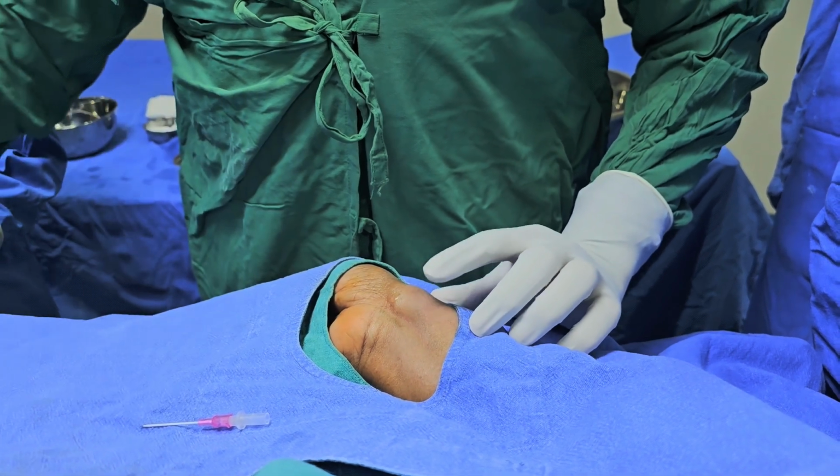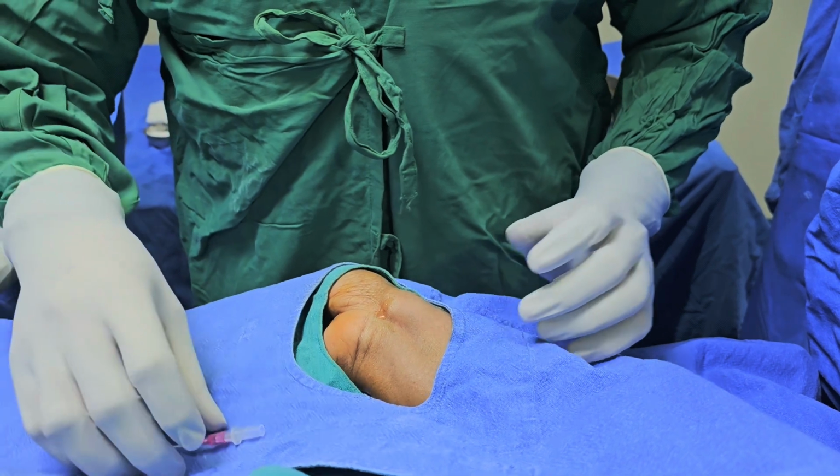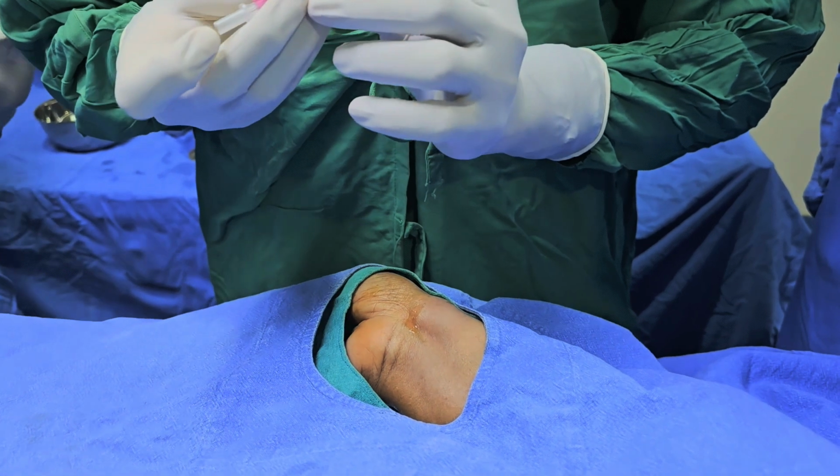Then take the puncture needle. We usually use a Gelco needle which has an inner stylet and an outer sheath. The stylet acts as the puncture needle.